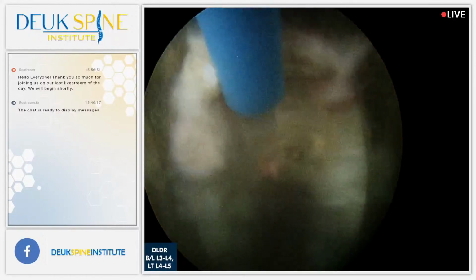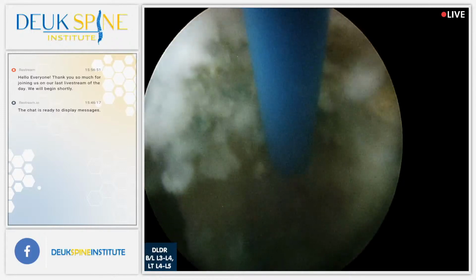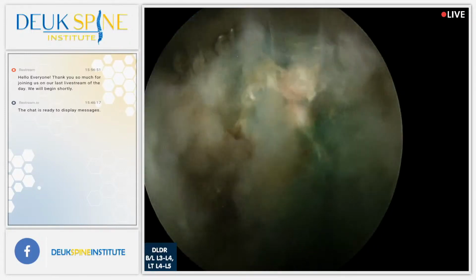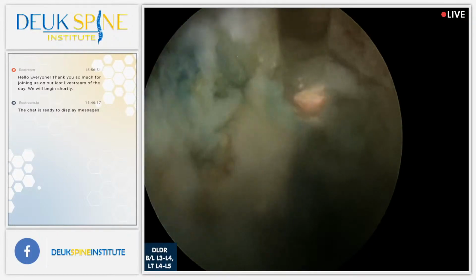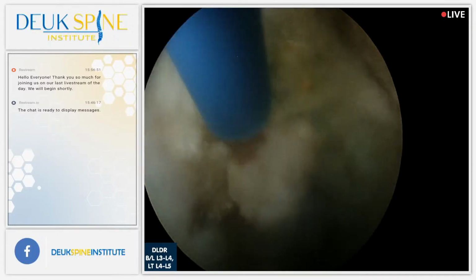Right, Luis? Just about done. 1 minute left here. How is our last patient waking up? There's a herniation right there. Yeah, I saw him in the chair. I didn't know if he was more awake or not.